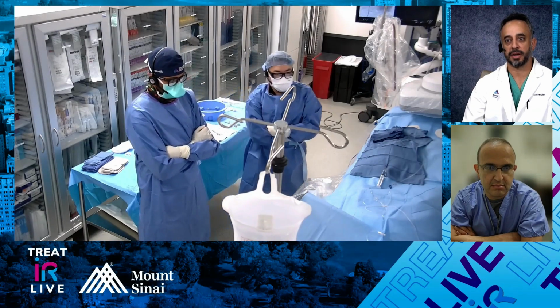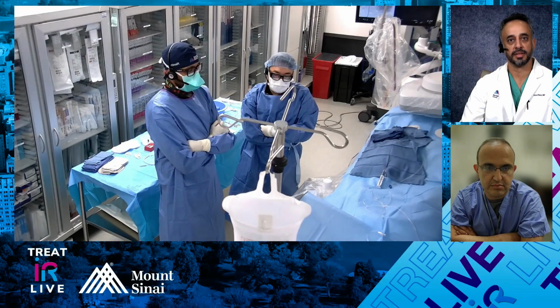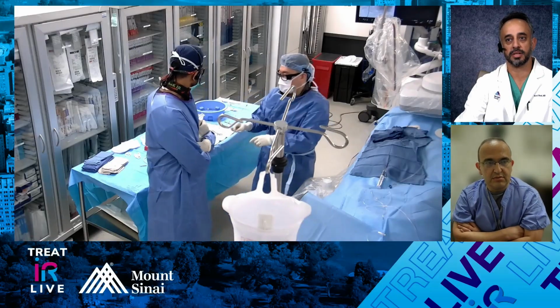So we tend to get a lot of splenic artery aneurysms through our liver cancer and liver screening program as well. Emil, how are you guys managing or seeing your patients for splenic artery or mesenteric aneurysms?